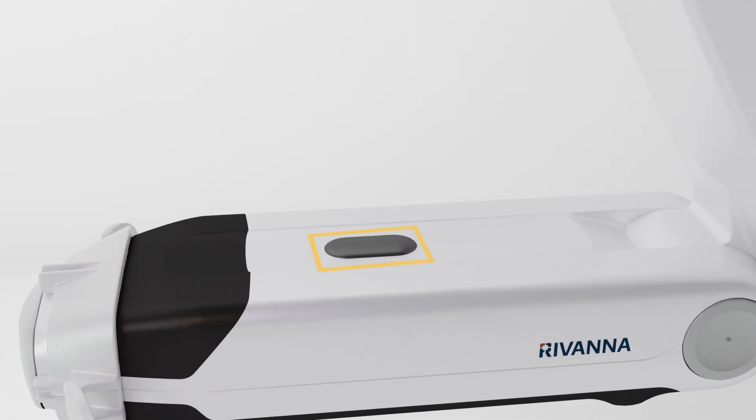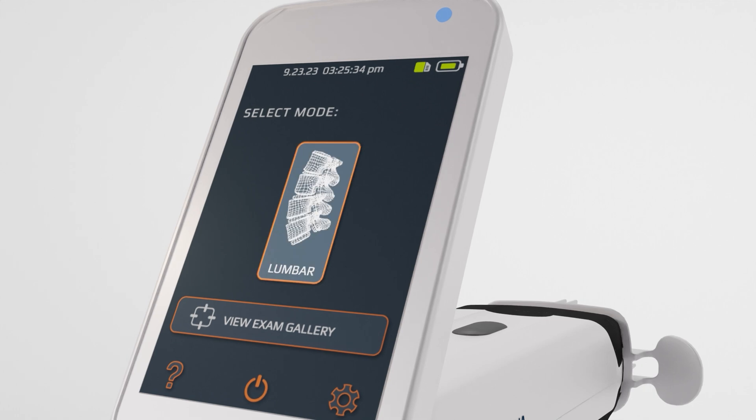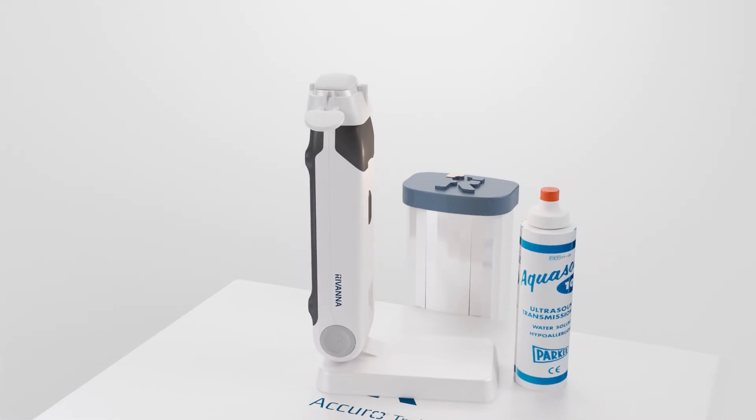The physical button turns on Acuro or puts it in sleep mode if already on. Select the lumbar preset. Apply ultrasound gel to the probe before scanning.